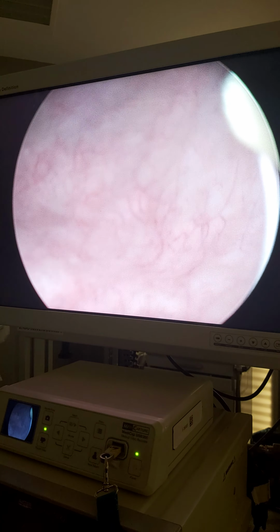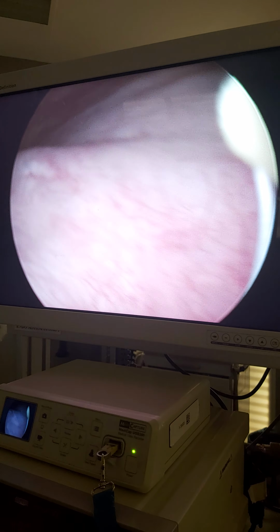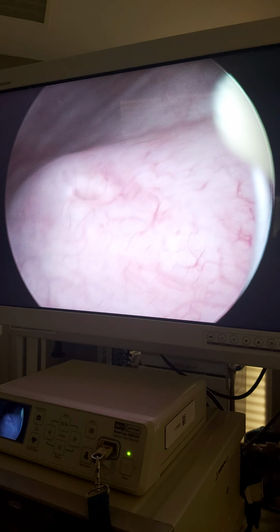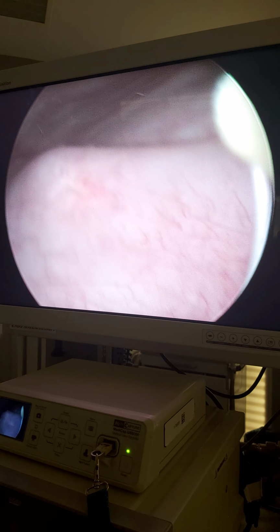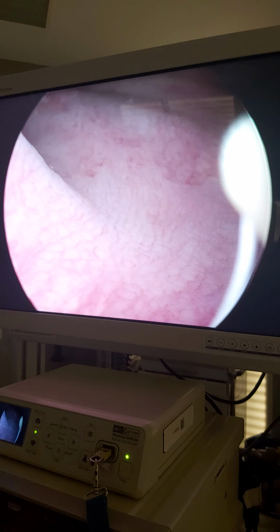Sometimes the kidney is also affected from these infections. This is also epithelial shedding, and it may be because of dehydration, waiting too much for the procedure in the hospital may also cause this, but sometimes this is because of infection. Look at the leukoplakia here. These are really too much.